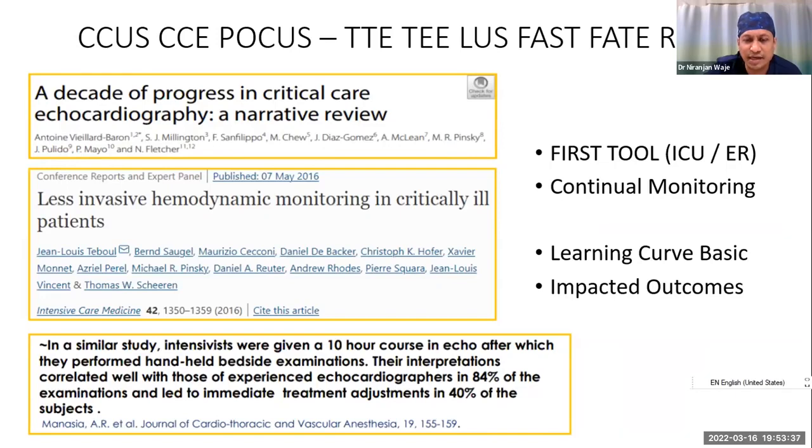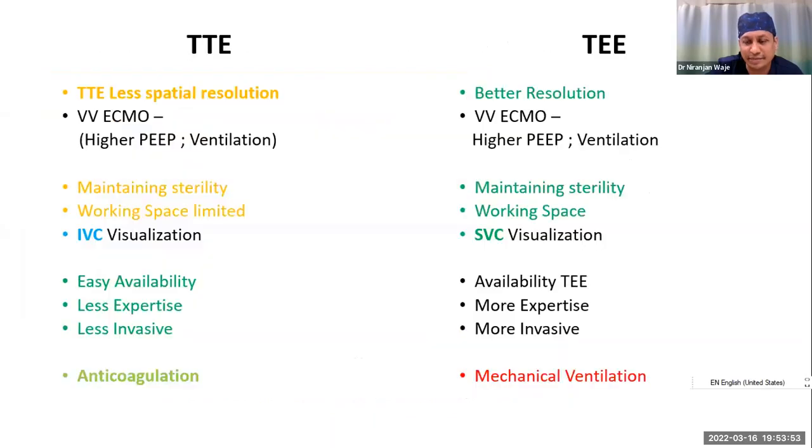In a 10-hour course, 84% of the people who were trained were able to identify findings, and their interpretation was equally good to that of experienced echocardiographers. 40% of them were even able to titrate the management in the right direction.